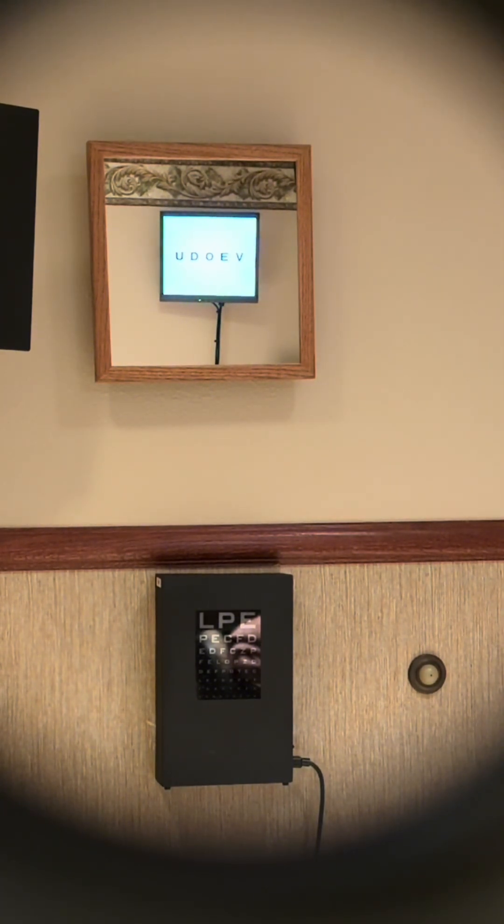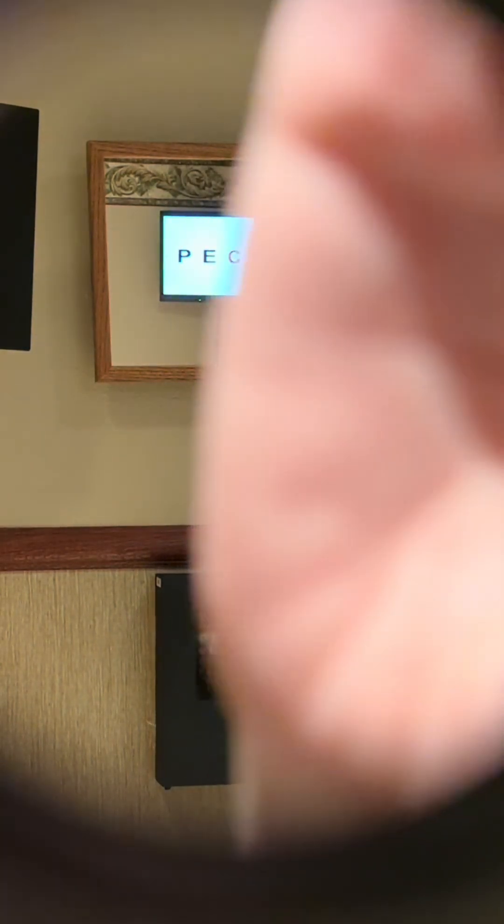I'm going to make them a little bit bigger still — add another lens here. We're going to be playing with your astigmatism now. Astigmatism just has to do with the curvature of the front surface of the eye, so it's not perfectly spherical in all directions — one direction is a little bit steeper, one direction is a little bit flatter. So I'm going to show you two options; they both might not be super great, just let me know which one's better.